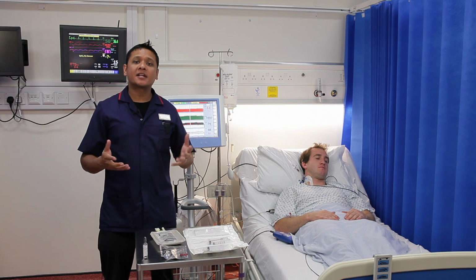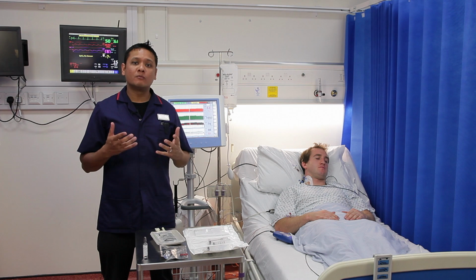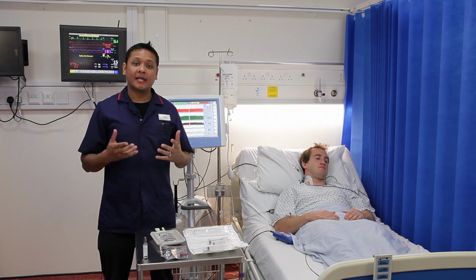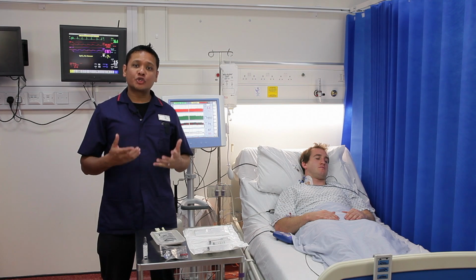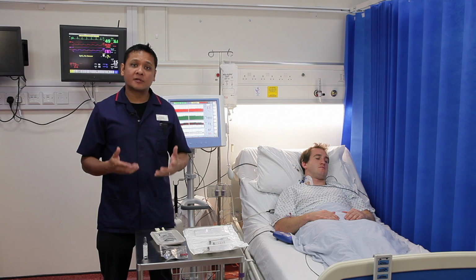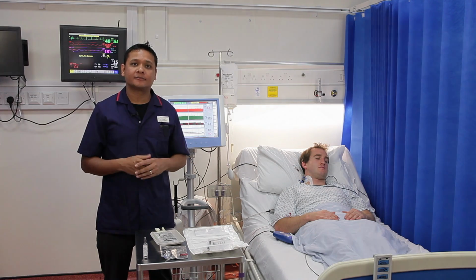The LiDCO Plus cardiac output monitor displays hemodynamic data to allow you to more effectively manage your patient in the intensive care unit. In this first video, I'm going to show you how to set up the disposables needed for the arterial part of the calibration technique.